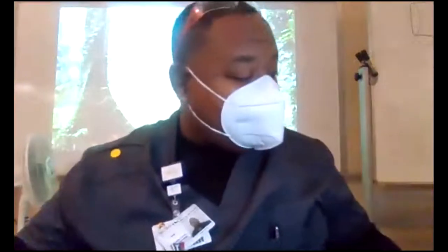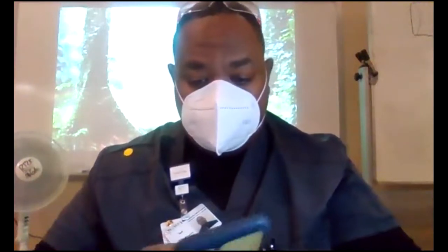I took a picture of a trach the other day that has secretions hanging out of the trach that are very, very dry because he wasn't getting the right humidity. When I came in, the water bottle was dry, was empty, and the secretions that come out of the trach on the end were crusty. That means it's dry. It's probably like that on the inside. So you have to be very, very careful. I don't know if you can see it through here. I tried to email it to myself so y'all can see it.